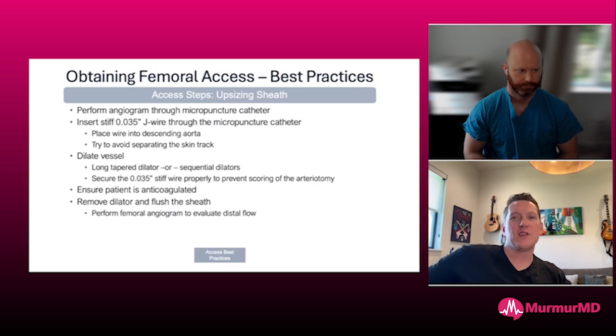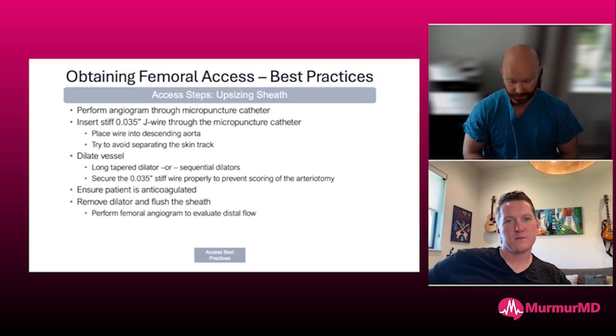So I think that's really the biggest part of the difference between DanGer Shock and some of the other trials, is these patients were sick. The operators were probably rushed. They probably didn't take as much time as they usually do on a protected PCI case. So. I completely agree. And we used to go as far as to deploy one Perclose, actually. In these patients, even though they were sick, we would still deploy one, so we would have a way to get closure later, to protect their vasculature, to be able to tighten that Perclose down around the repositioning sheath.